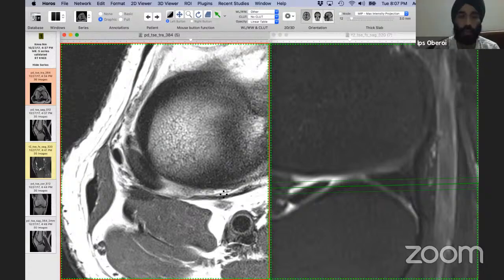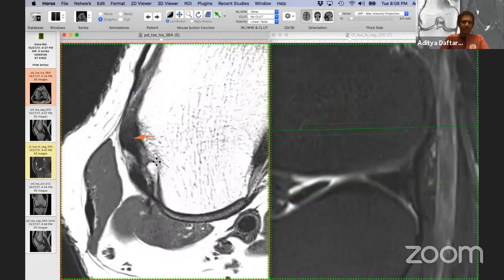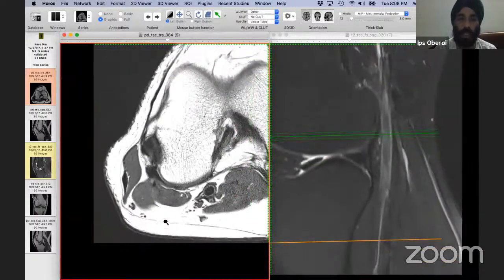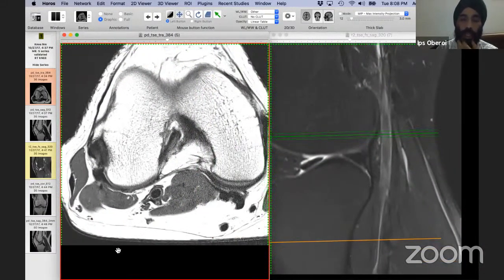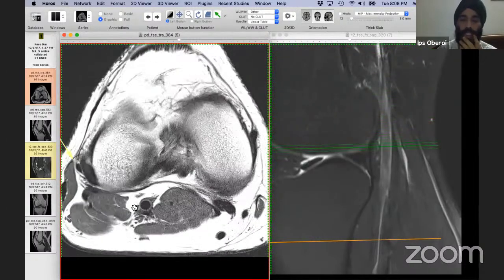Two questions have come in on the chat box. Dr. Arun Gupta asks, can you measure the diameter and length of the hamstring tendons, which we need for autograft? Yeah, we can measure those. Absolutely. Perfect. Another question is, Dr. Shantaram wants you to describe the post-op imaging. How do you image a post-op meniscus repair or meniscectomy?